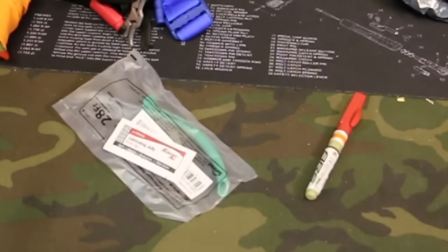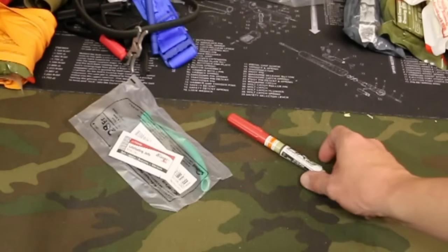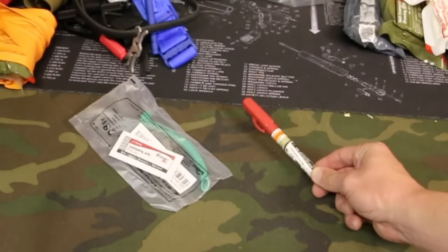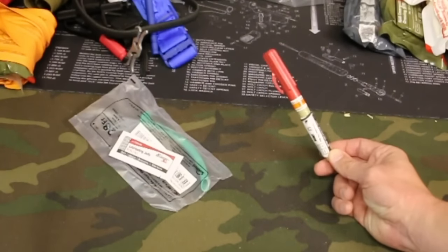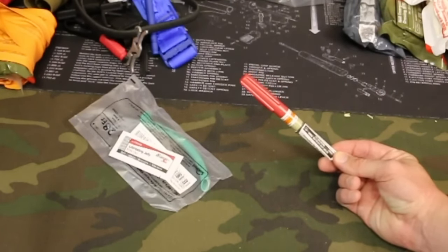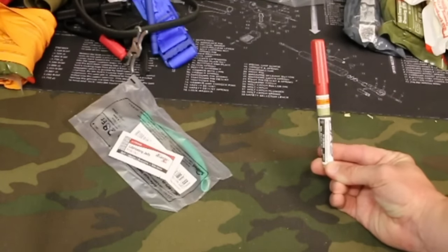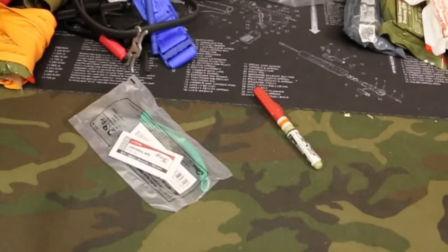Two other items you can look at adding to your trauma kit: an NPA. This is going to protect someone's airway when they're not conscious and their tongue is falling back onto the throat. It inserts without hitting the gag reflex and protects the airway. Another thing you can add, if you have the training, knowledge, and availability, is a needle for your trauma kit. This is a chest decompression needle that will relieve a tension pneumothorax, which is life threatening. But this takes training — if you screw this up you can be held liable. Make sure you have the training and are legally allowed to carry this.